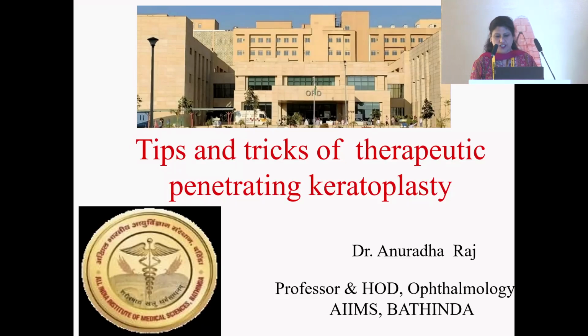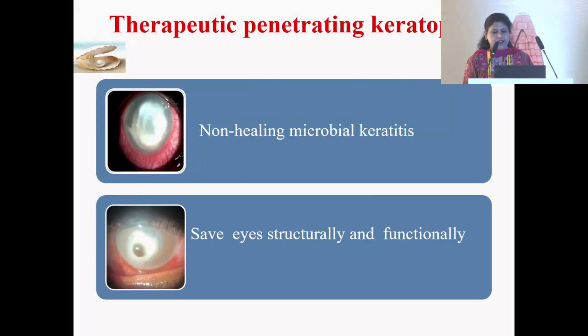The topic of discussion is tips and tricks of therapeutic penetrating keratoplasty. Therapeutic penetrating keratoplasty is done for non-healing microbial keratitis, and it is a very important surgery because it saves the eye structurally as well as functionally.